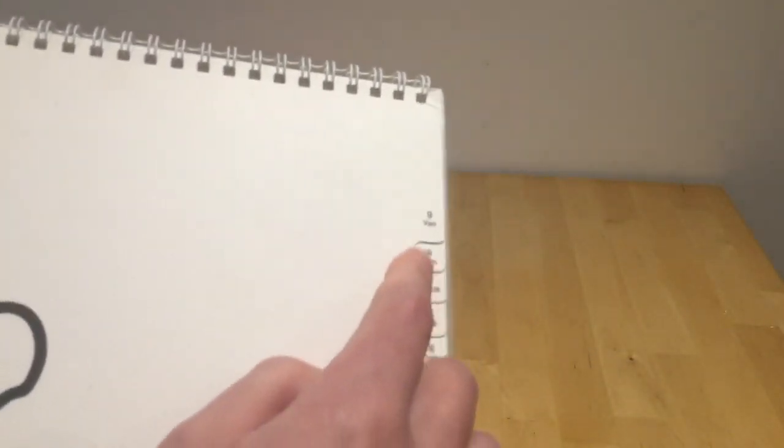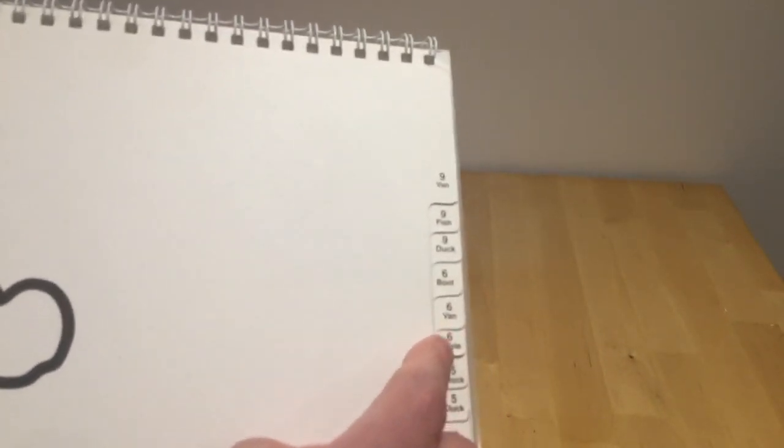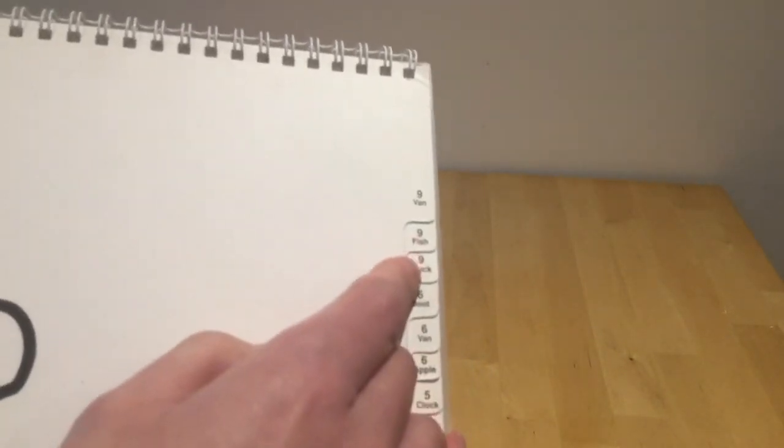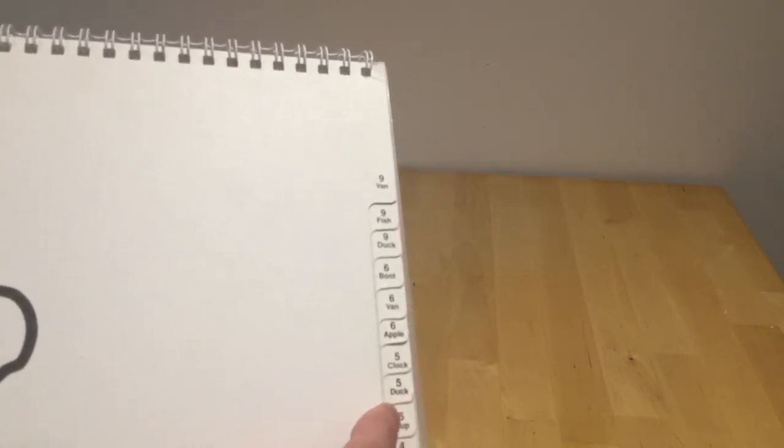Now if I keep the book on this side, when I now move to the right, you will notice that they're getting smaller. Pictures are on both sides. So you go through 9, 6, 6, 6 would be regarded as being normal vision, but we actually go further in this screening booklet. So we go to size 5, size 4, and size 3.